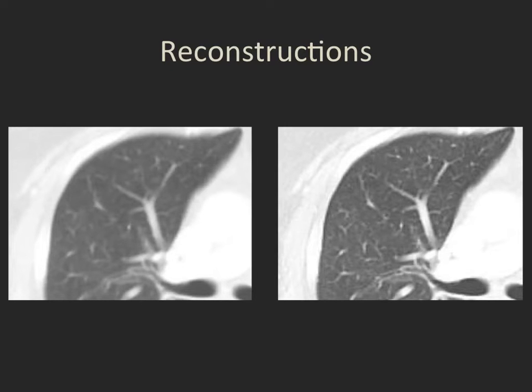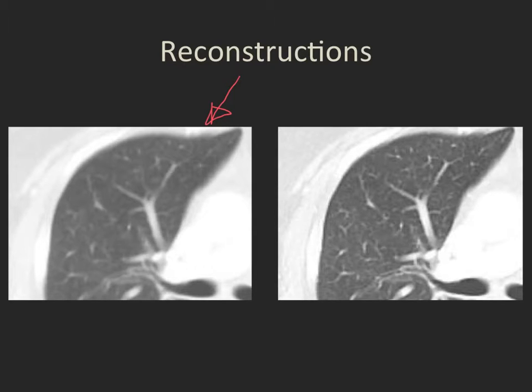Here are two slices of a patient's CT scan. The technologist has applied two different software algorithms to reconstruct slices through the thorax. On the left, reconstructed with a conventional soft tissue algorithm — the lung parenchyma is visible but a little blurry, shown here in lung windows. On the right, reconstructed using a typical lung algorithm — very crisp and contrasty, giving excellent resolution of small vessels within the lung parenchyma.